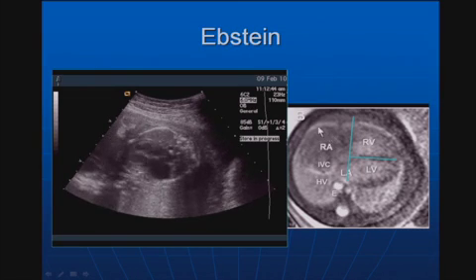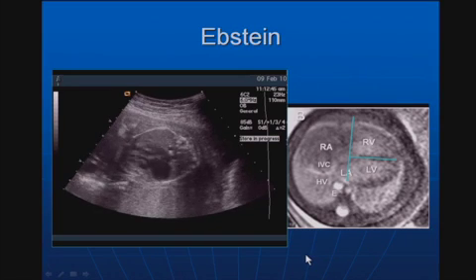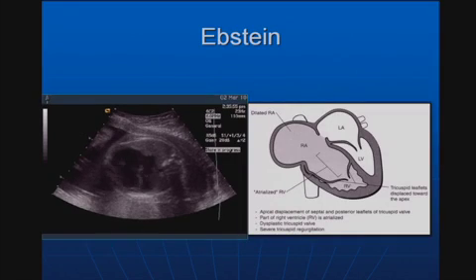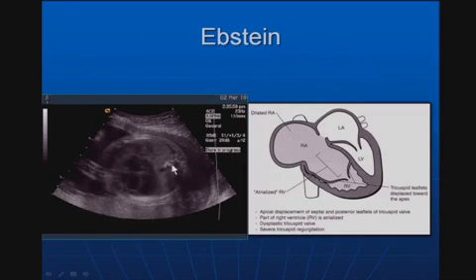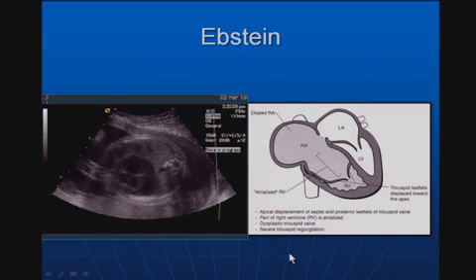This is a case with an in utero fetal ultrasound showing an enlarged right atrium and an abnormal axis. 4 weeks later, we can see this quite easily, where there's dilatation of that right atrium and the axis is very abnormal.